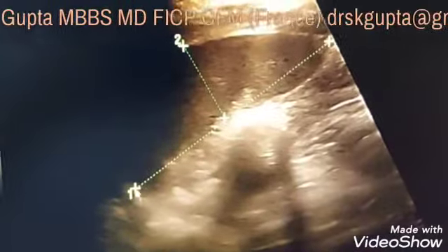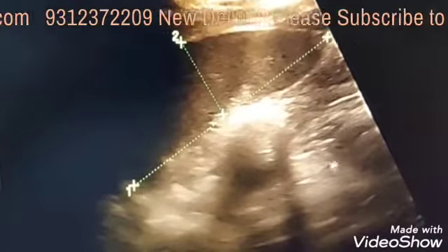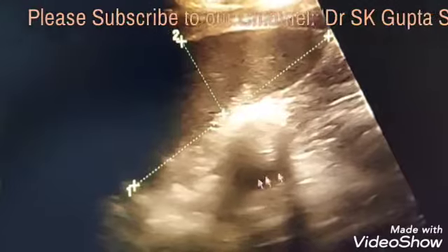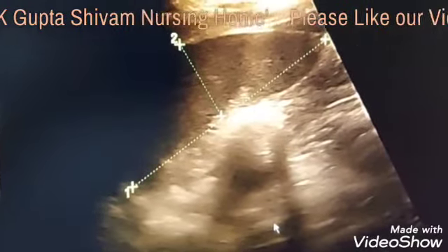This is the right kidney — you can see it comfortably well and this is a normal kidney. If I go to the left hand side, I find that the spleen is visible, but just next to the spleen there should be a kidney, but the kidney is not here. This is the psoas muscle.